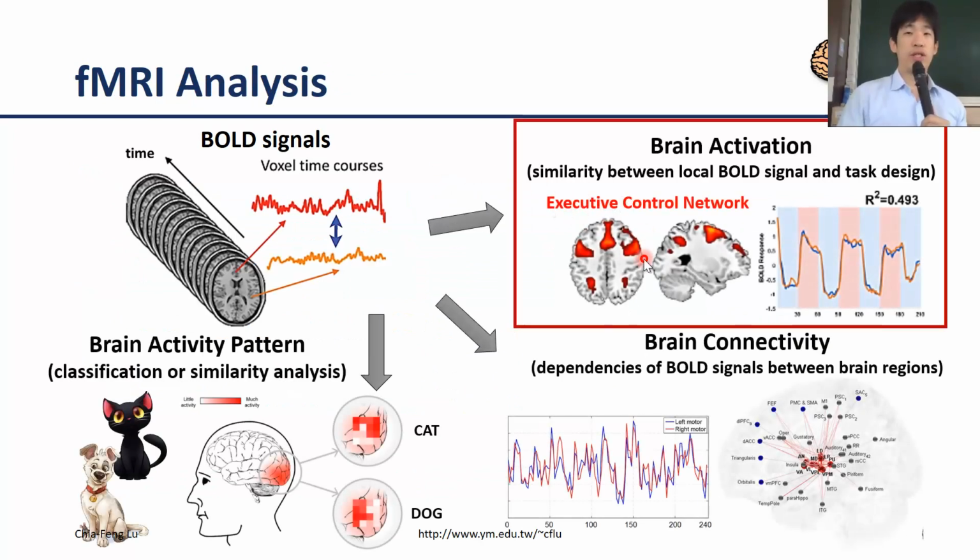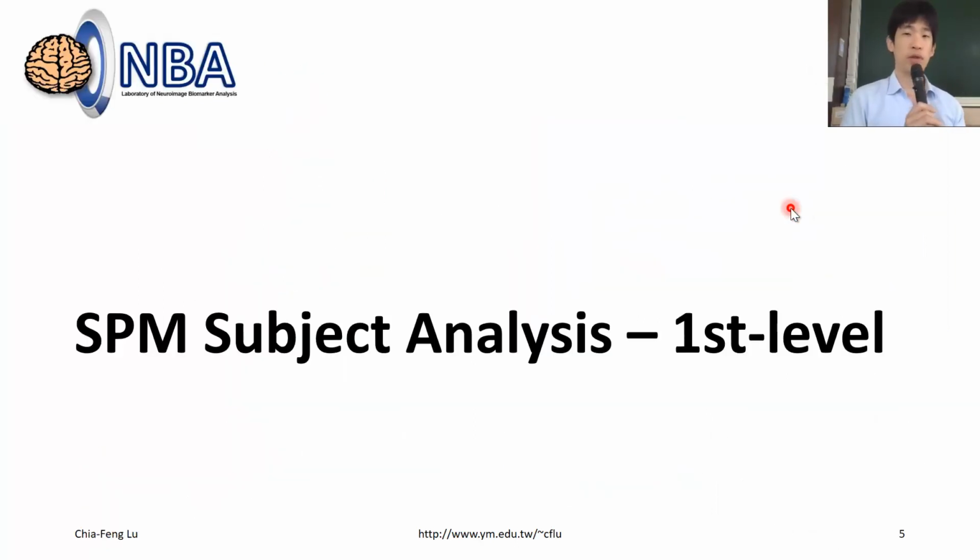Again, we are still working on the very first part, that means the brain activation right now. But today we are going to introduce the group-wise analysis, the so-called second-level analysis. So let's start from the very first part.